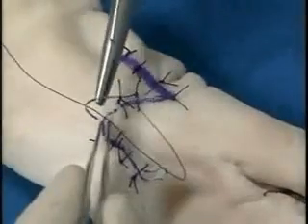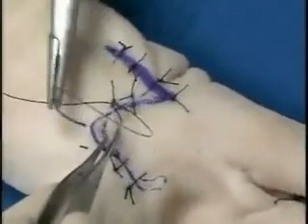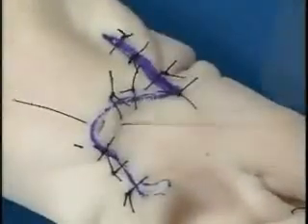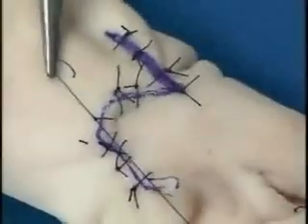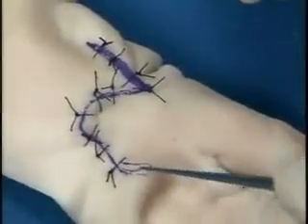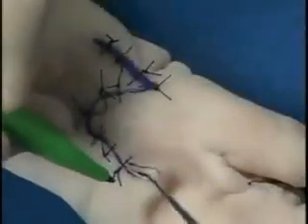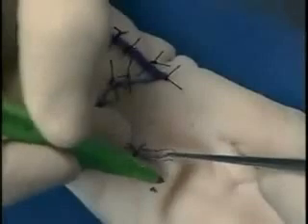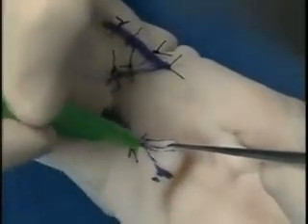And now the final stitch is put into position to close the wound, and the flap is now nicely in position, closing the defect. Here we have the dog ear. A hook is placed. The line of the back cut is marked. Always place the hook at the apex of the dog ear and always cut away from the flap, so you do not want to interfere with the blood supply.